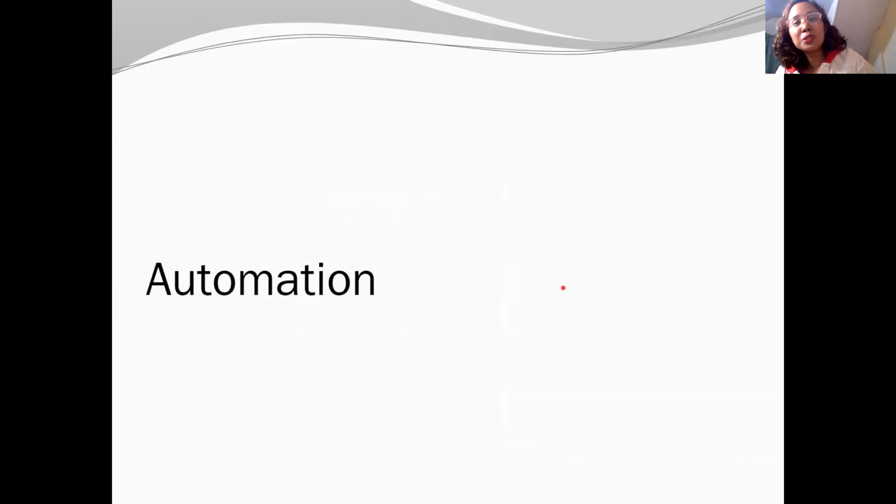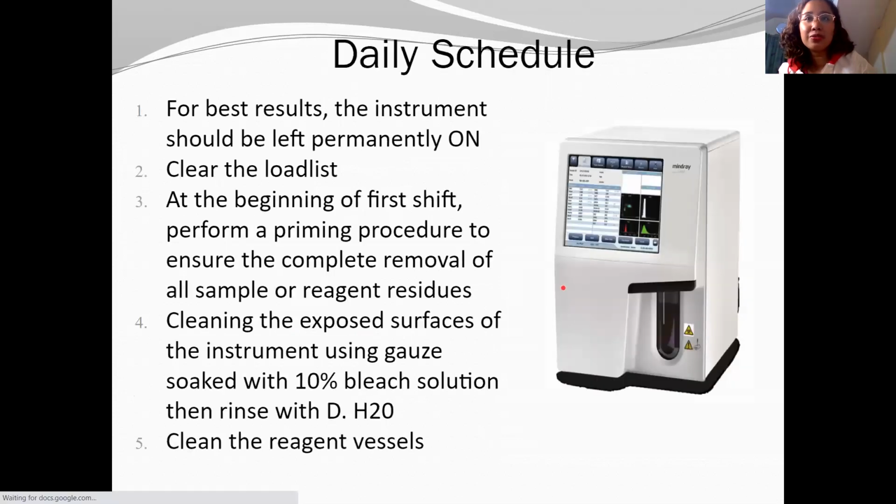Sige, mag-proceed na tayo sa automation. So, our best friend in hematology is your hematology analyzer, okay? Pag nag-bug down to, magmamanual ka, okay? So, you have to take care of them. Before starting your shift in the morning, dapat lahat ng AM shift, ito ginagawa nila, okay? So, it should be on. Hindi na dapat ino-off.